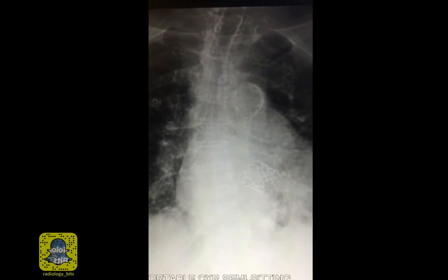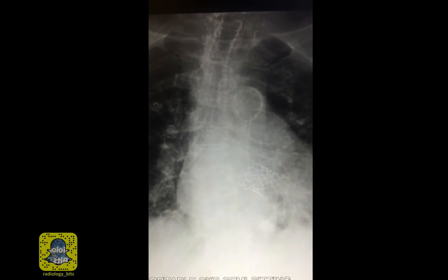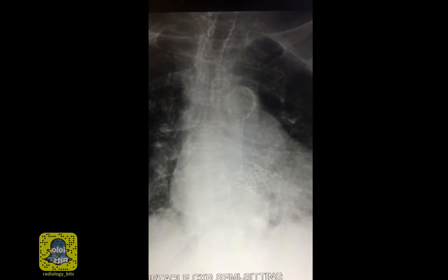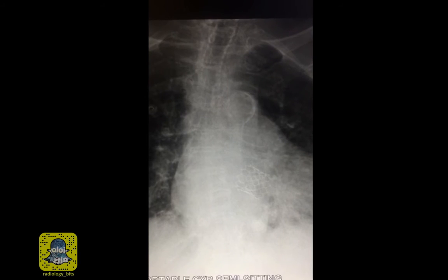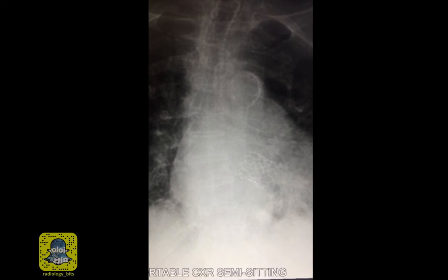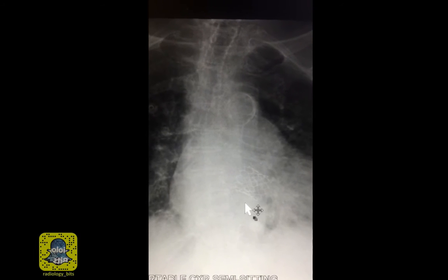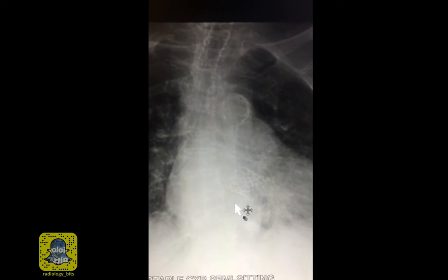The femoral approach is not the only approach. This has been approached by trans-subclavian or trans-radial approaches. Some institutions have also tried inserting this directly through an opening through the ascending aorta. A transapical approach, by which an opening through the apex of the left ventricle is used to reach the aortic valve and place it, has been used. However, this has been abandoned currently in view of the other easier and more successful approaches. Two different types of valves could be used: a valve that is self-expandable or balloon expandable.